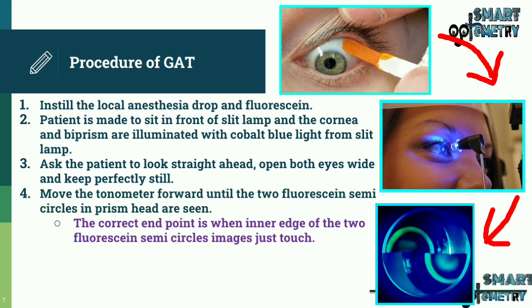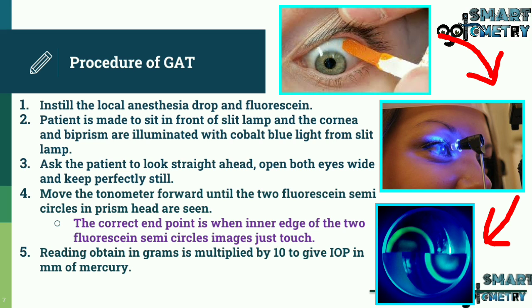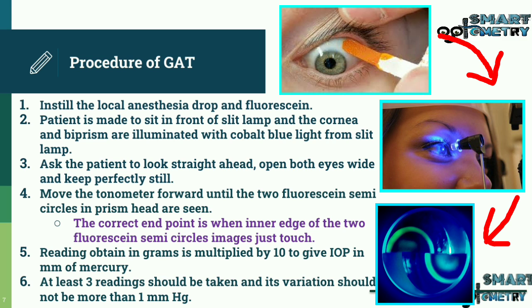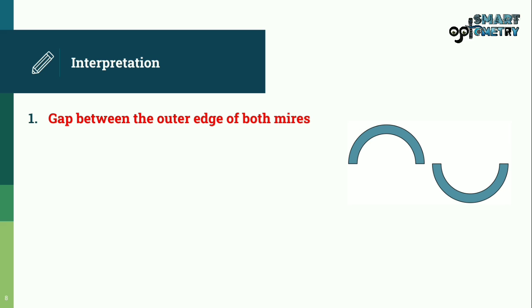Ask the patient to look straight ahead, open both eyes wide, and keep perfectly still. Move the tonometer forward until the two fluorescent semicircles in the prism head are seen. The correct endpoint is when the inner edges of the two fluorescent semicircle images just touch. The reading obtained in grams is multiplied by 10 to give IOP in mmHg.